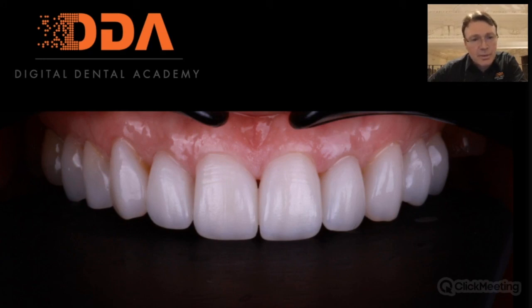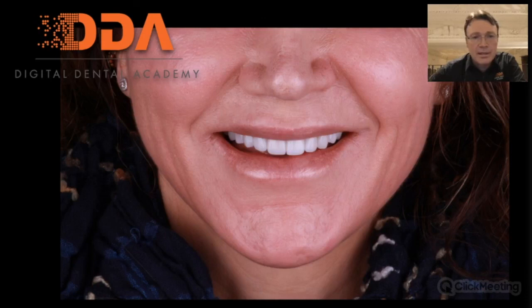So we did a mixture of crowns and veneers for this patient, and this was on a week and a half follow-up. All the smile designs that we do in one day, we use CEREC software, or depending on the case, ExoCAD or InLab, depending on what we needed to do. But for this patient, we did 4 crowns anteriorly, and then on the canine and the premolars, we did minimal prep veneers. But all done on the same day, same visit. So the patient gets it prepped in the morning, and then we fit it in the afternoon. And that's the smile at a little bit wider angle.